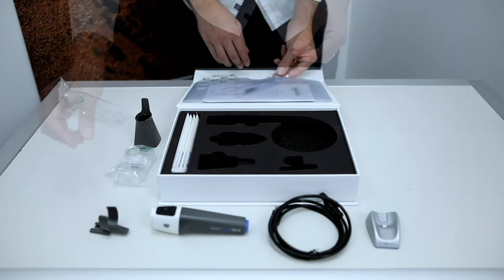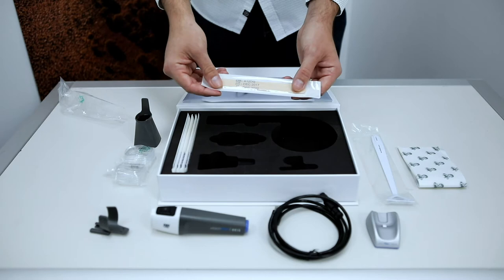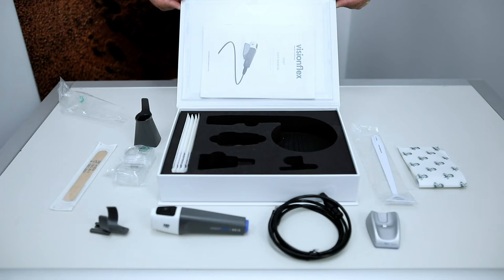You'll also find one clip to attach the GEIS and hold your accessories, one wound measurement stick, five sheets for the wound measurement stick, ten tongue depressors, and your instruction manual in the pocket located on the inside cover of the lid.